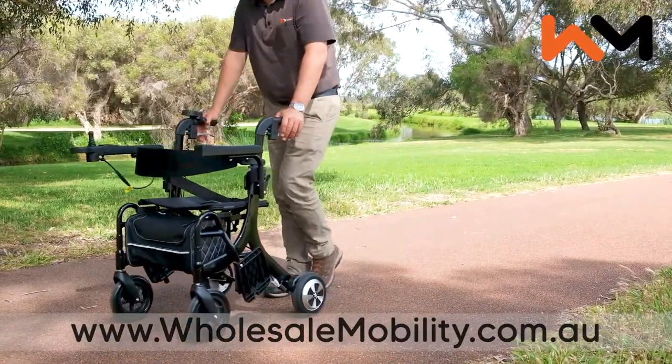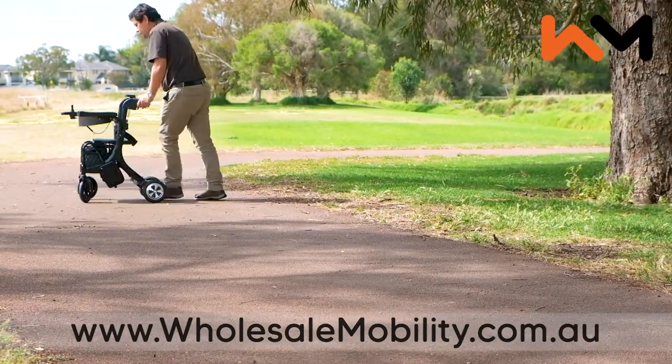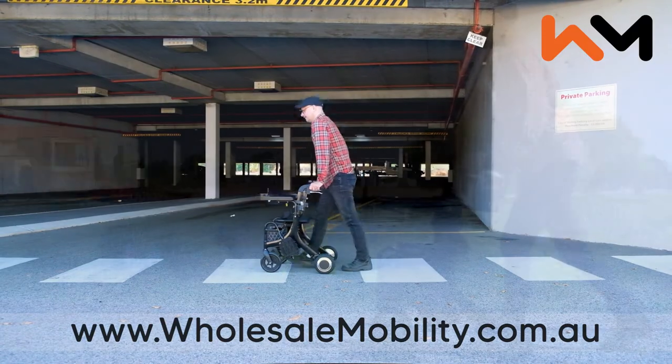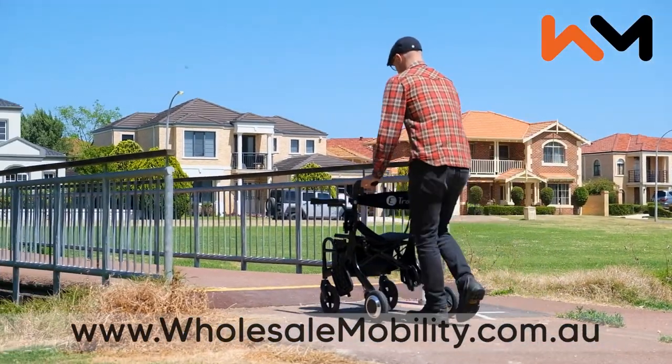Used as an electric rollator, the Evo shines, allowing for easier and safer travel up and down hills or transporting shopping thanks to the push assist function. Alternatively, the Evo can be turned off and used as a manual rollator.